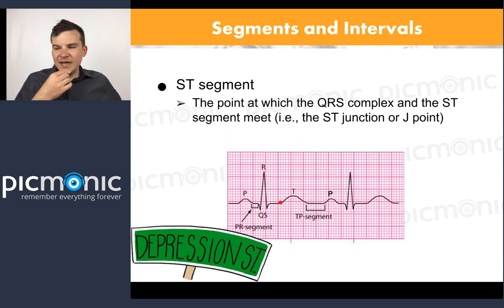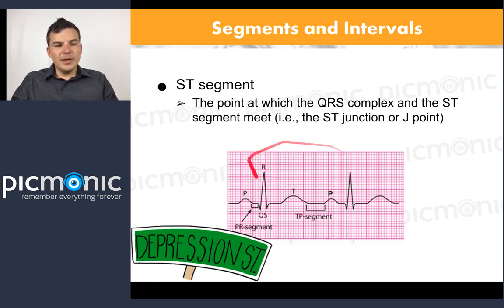Well, if you're thinking about cardiac injury, yes, that's absolutely right. It can be cardiac ischemia and then cardiac infarction. So ischemia just means oxygen starvation, so it's oxygen deprived. Whereas infarction actually means cell death. So if we have cardiac ischemia, we may see a depressed ST segment. But if we have a true infarction, that's where we see ST segment elevation, and that's absolutely right. That's just really important to make sure that you know those.